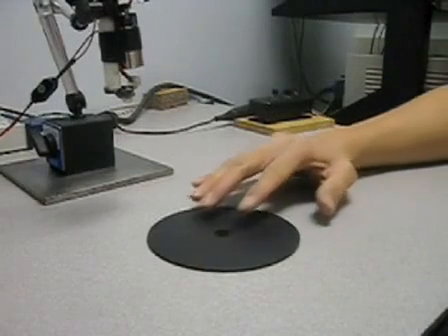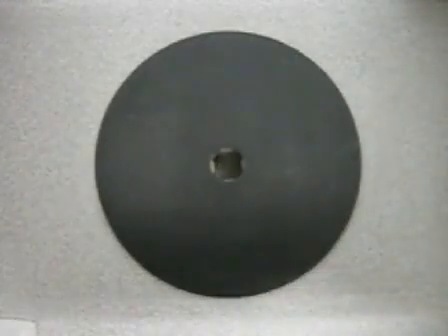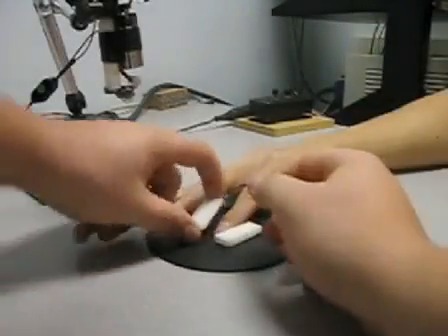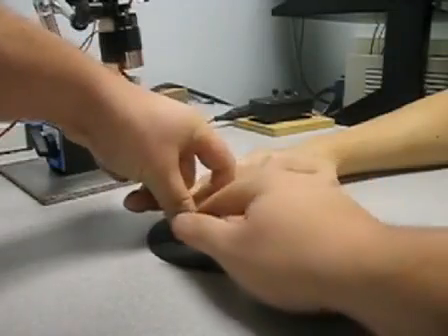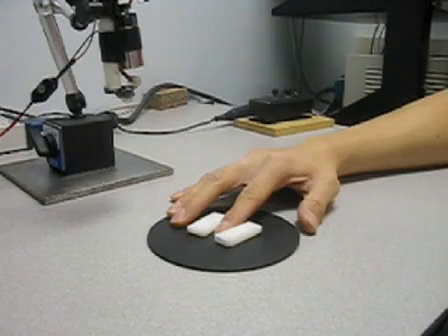Once the subject's arm is in prone position on the tabletop, place the distal pad of the finger to be tested over a tunnel in the table through which the stimulus surfaces will rise to contact the skin. To prevent lateral finger movement, gently place two barriers coated on the bottom with double-sided foam tape against the sides of the finger.